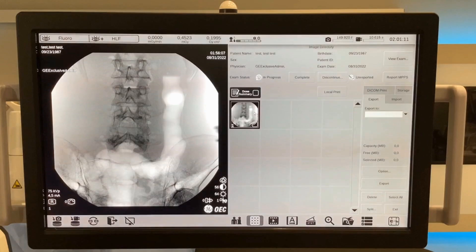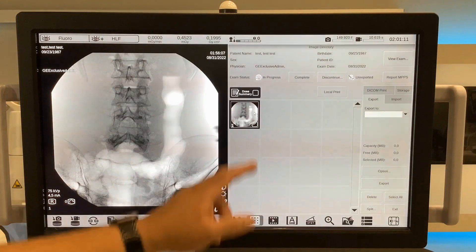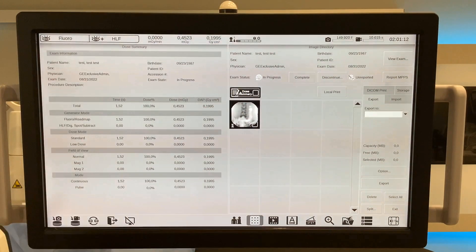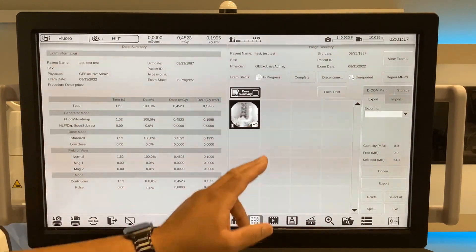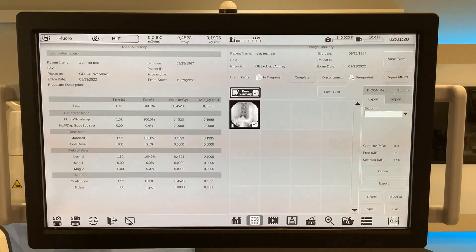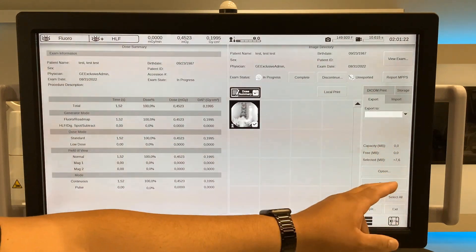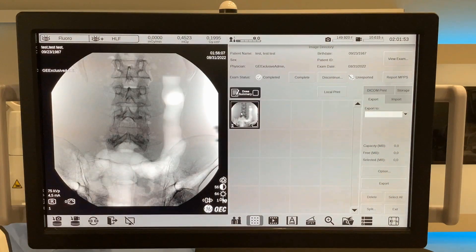The case dose summary is also able to be sent. The dose summary is located above the images on the left-hand side. To view, select dose summary. To send, check the box for selection. Either export or send depending on location.